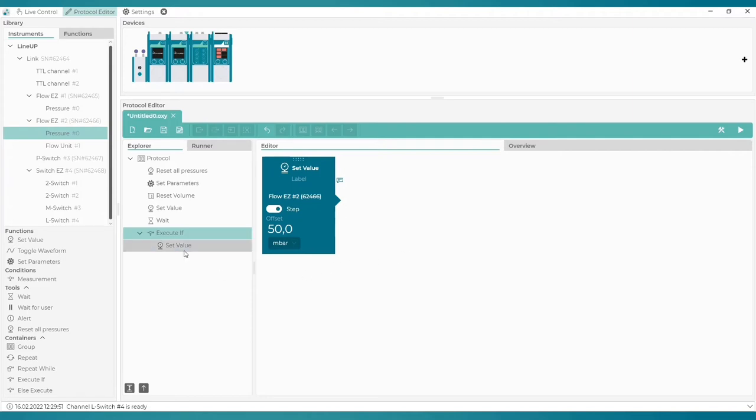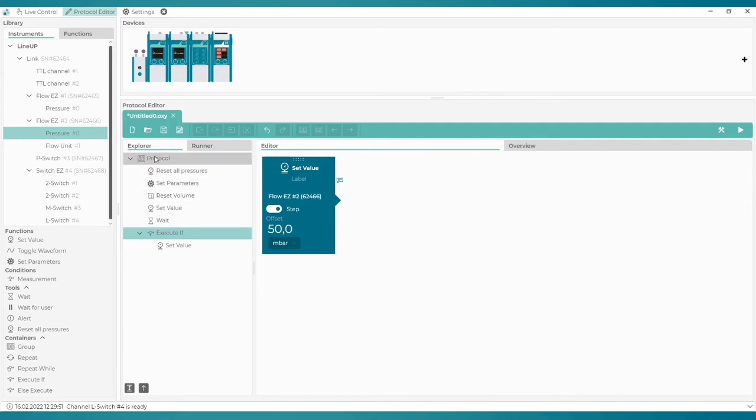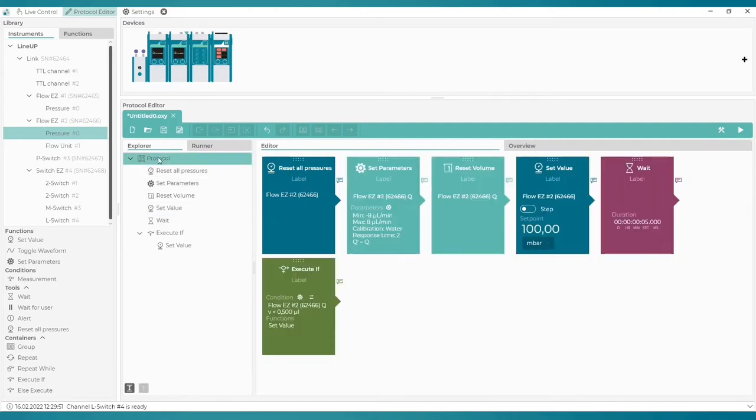We can see that this block is now featured within the Execute If block in the Explorer tab. You can expand as well as collapse this list. Okay, so the first condition is ready.